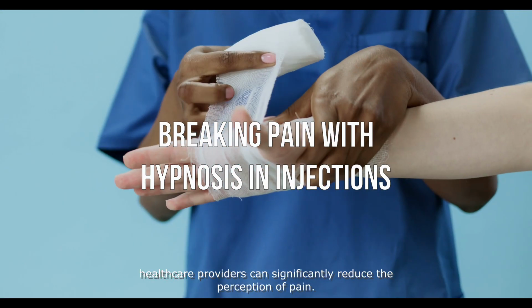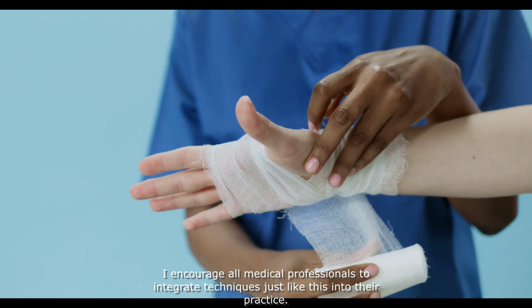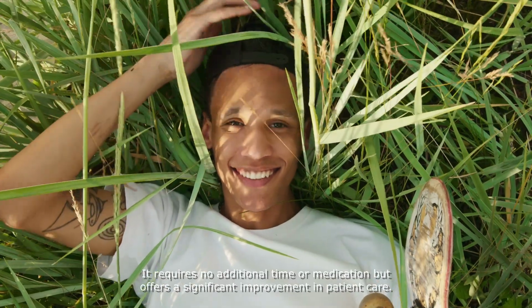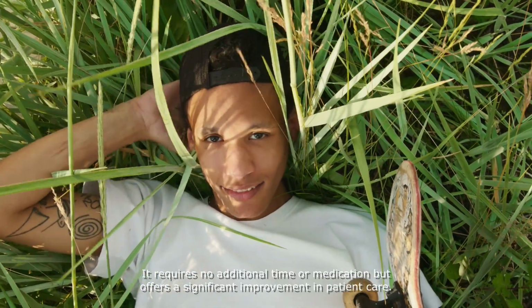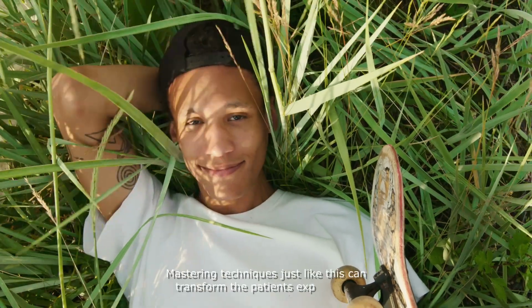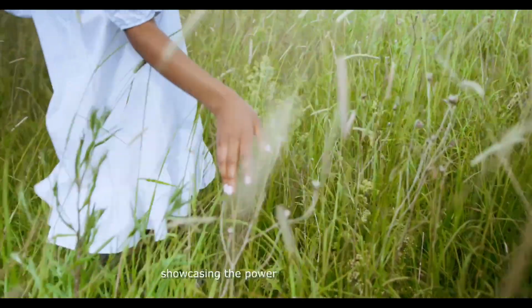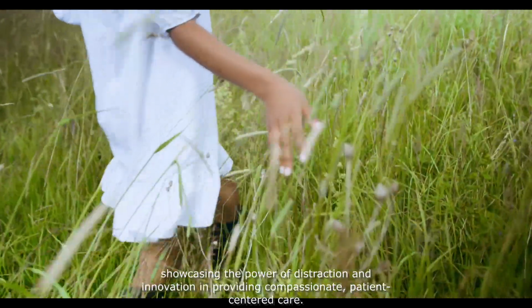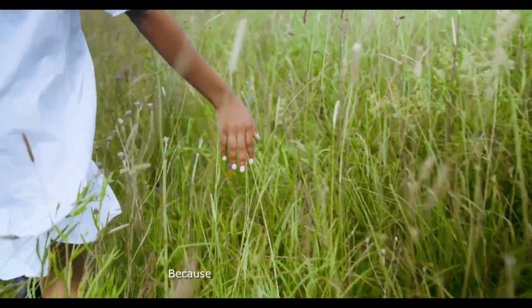of pain. I encourage all medical professionals to integrate techniques just like this one into their practice. It requires no additional time or medication, but offers a significant improvement in patient care. Mastering techniques just like this can transform the patient's experience, showcasing the power of distraction and innovation in providing compassionate and patient-centered care, because you're perfect just as you are.